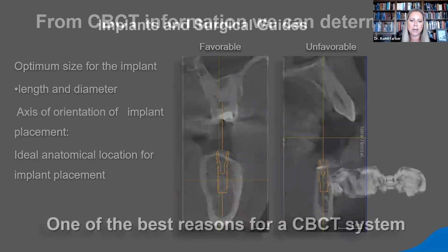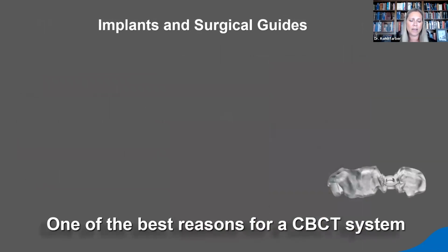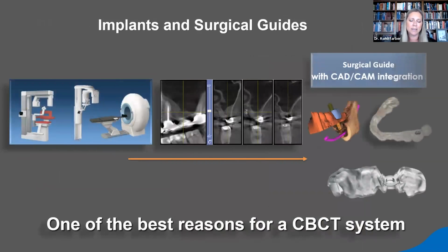I would say also one of the best reasons for CBCT systems is the surgical guides. And especially if you're just starting out and you're kind of nervous about this whole process, a surgical guide is such a godsend. It's going to tell you exactly how to do everything. It's going to come with a nice little recipe to follow.